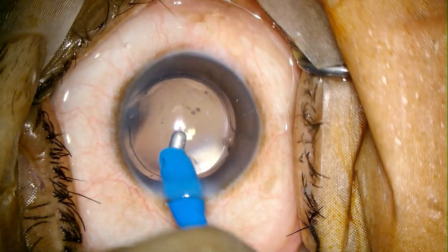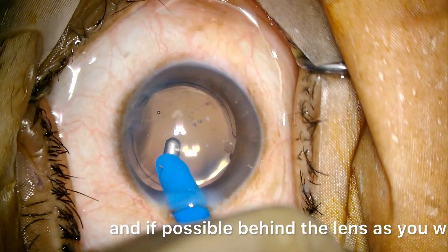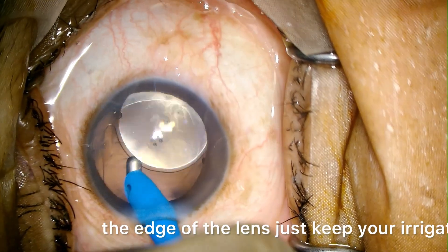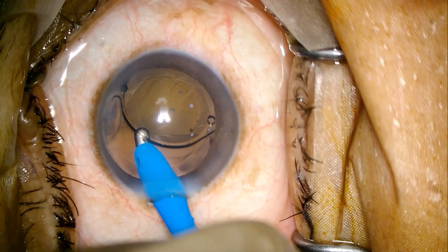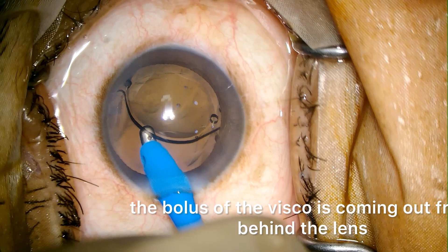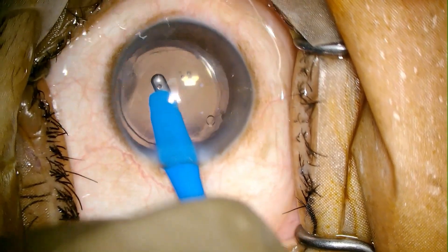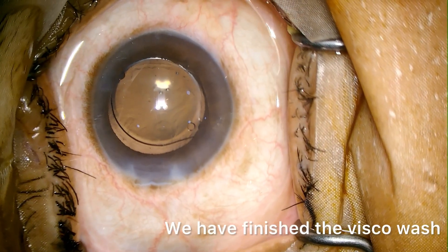Now we are washing the remaining visco above the lens. It's very important to wash the visco properly above the lens and if possible behind the lens. Now we are going behind the lens, just near the edge of the lens. Just keep your irrigation on and when you are confident, you can do aspiration also. The bolus of visco is coming out from behind the lens — slowly. Don't be in a hurry here. We have finished the visco wash.